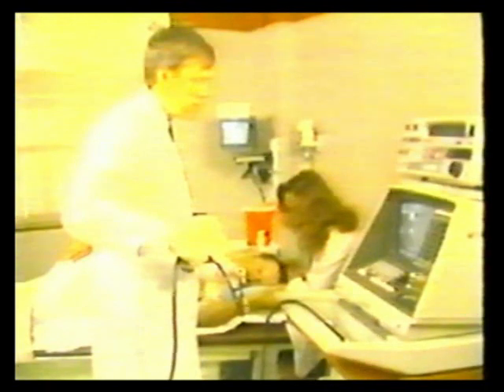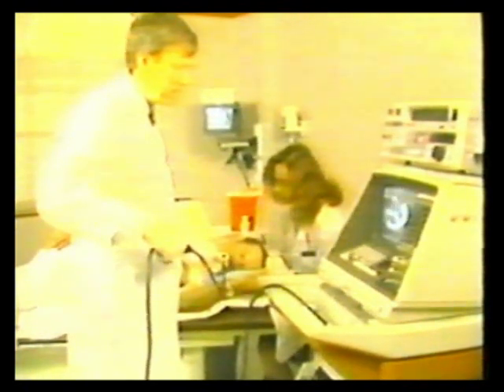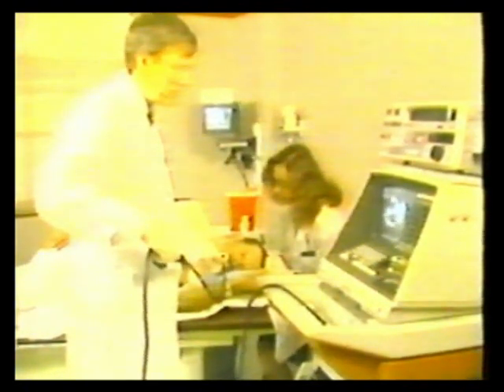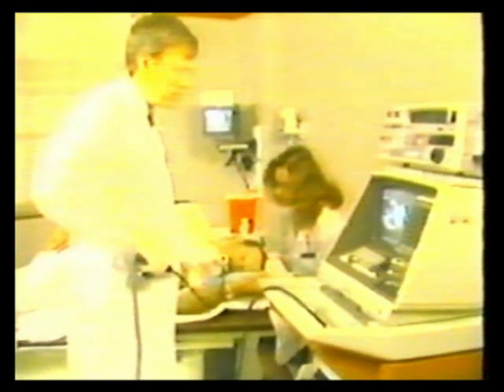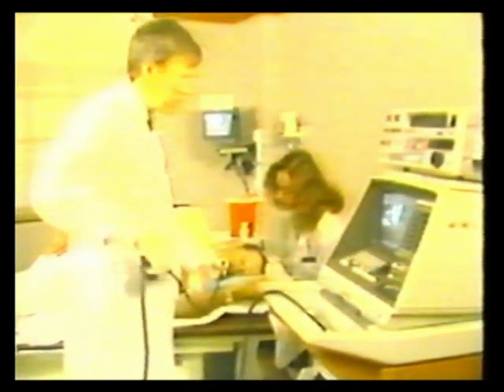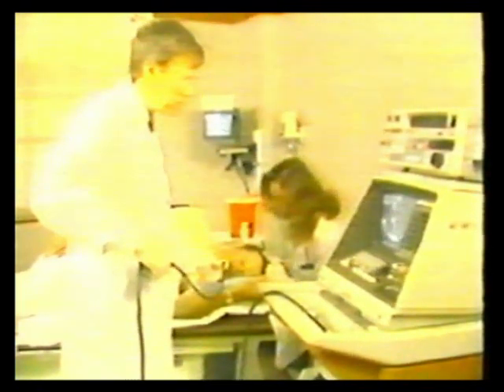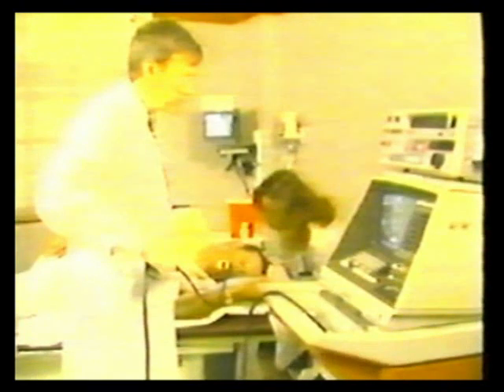The assistant monitors the patient, assisting him with breathing and suction if necessary. The examination takes approximately 15 minutes. This allows for appropriate basal, four-chamber, transgastric, and aortic views to be obtained.